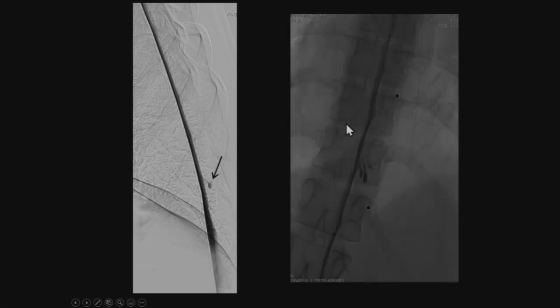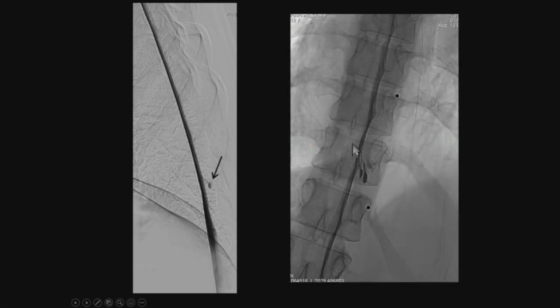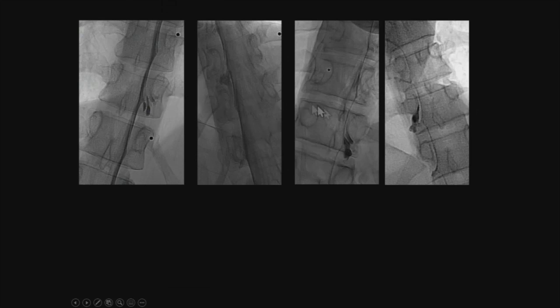Her spine showed obvious longitudinal collections on axial view. Whether the collection is cervical, ventral, dorsal, or lateral, it doesn't matter — you won't be able to localize it until you do the dynamic study. We put her prone according to our protocol, and on the prone myelogram you see a little bit of leakage that looks posterior lateral. We turned her lateral to see it better, and in the lateral projection you can see the typical appearance of the loculation and the collections of contrast getting into the epidural space and then going free up and down the canal.